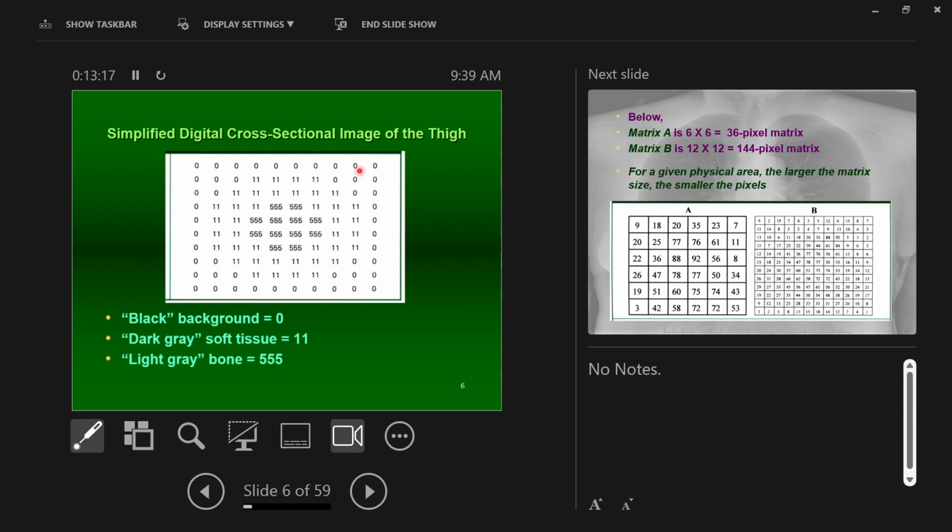For my newest people, I know you maybe haven't had anything on this yet, right? There's a thing called an X-ray tube in the X-ray room. It's the thing that sits above the table and produces an X-ray beam. You can think about the X-ray beam just like light, okay? I'm digressing a little bit for many people. It's the same type of thing as visible light, okay? It's made in a very similar way that visible light is made. We just do it at high energies.